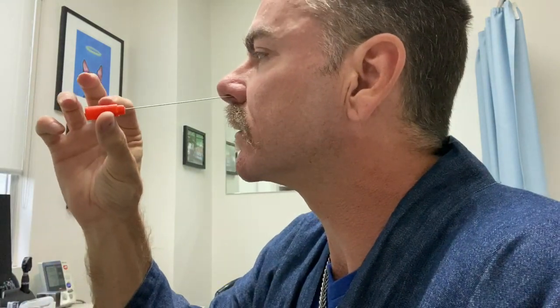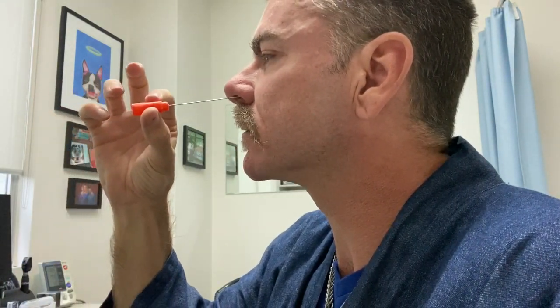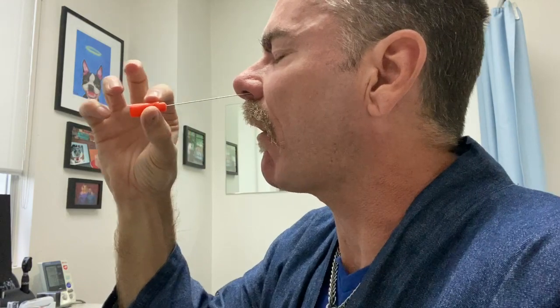I just want to show you that it's not nearly as bad as you think it is. It's just going to go into the nose, sliding a little, tap, tap. That's it, it's done. It felt a little bit uncomfortable, and it does give you that tickle in the back of the nose, but it's done.